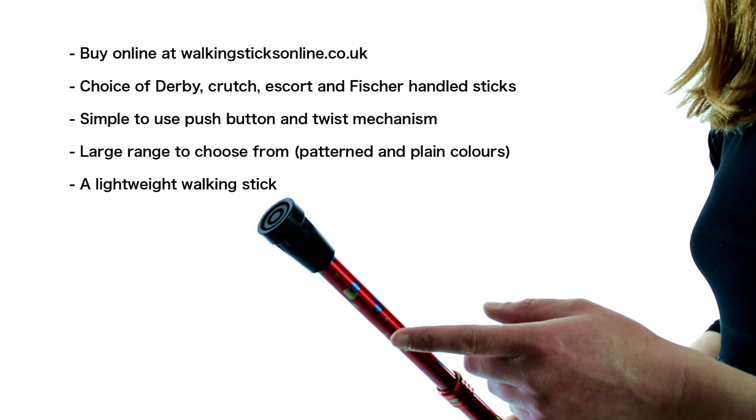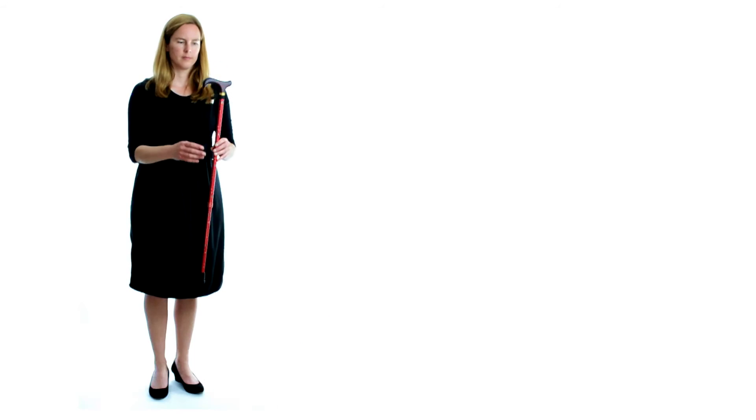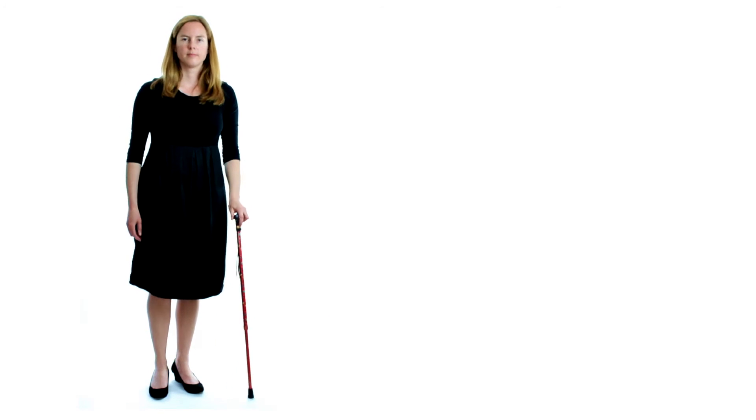Adjust the height easily by twisting the collar, pushing in the toggle, and then twisting the top section to move the toggle to the next hole up or down. When the correct height is set, tighten the collar again. All sticks are supplied with a rubber ferrule.